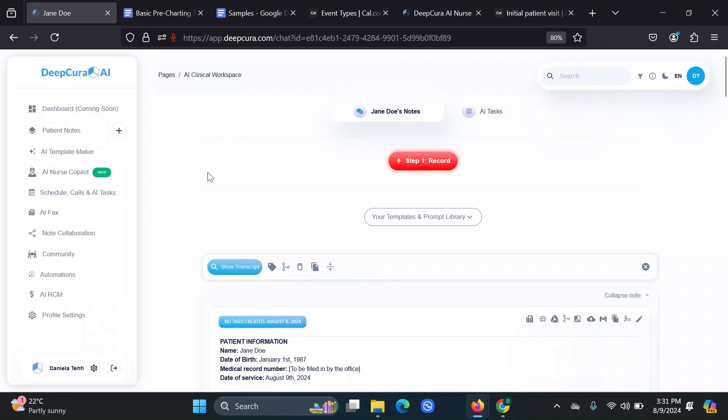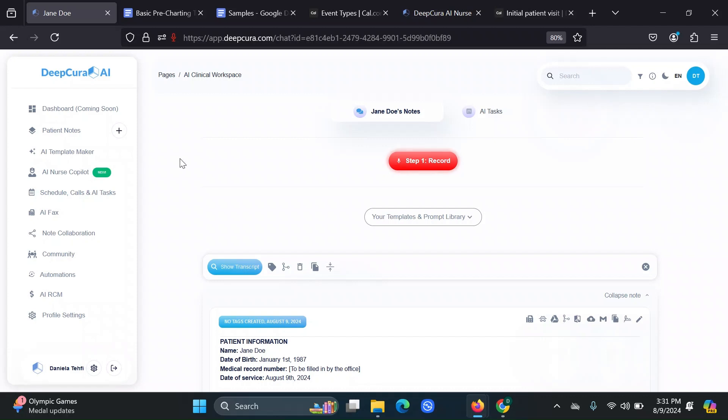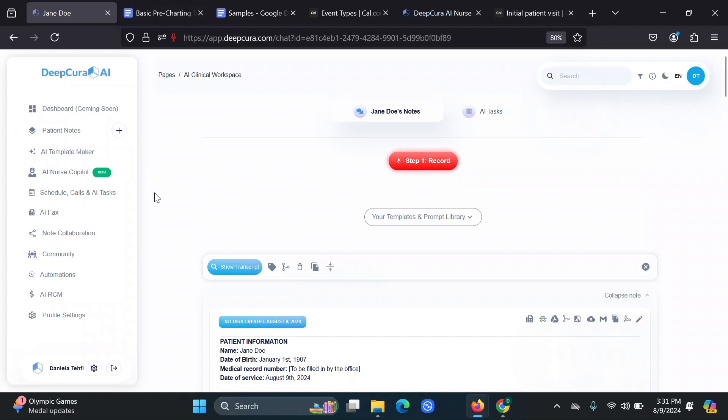So that's basically the way that you use the AI nurse copilot. Remember that we are going to have a few pre-made templates for you in the library, so it's not as overwhelming for you to come up with the instructions on your own. And you can just take those and make it your own if you would like.